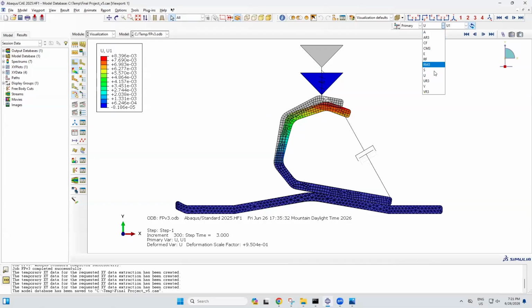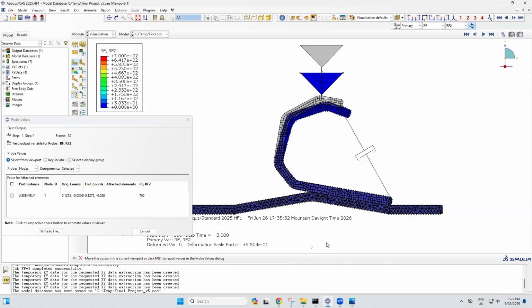Next, we'll want to verify that our part is really working. Using the vertical reaction forces, we should end up with a resulting downward reaction force at node 1, or ground, which is down here. The resulting reaction force is 700 newtons, which makes sense considering we had a downward body force of 700 newtons. This is proving that we did everything right.